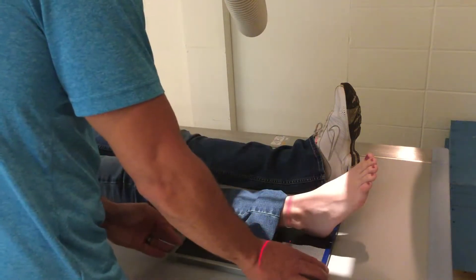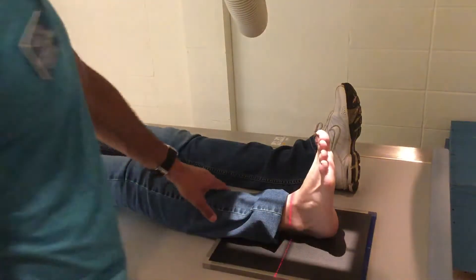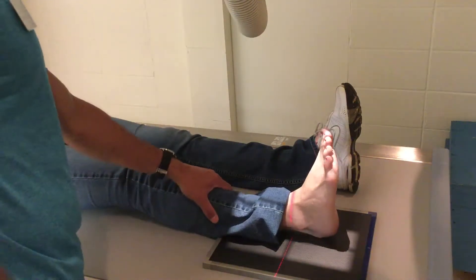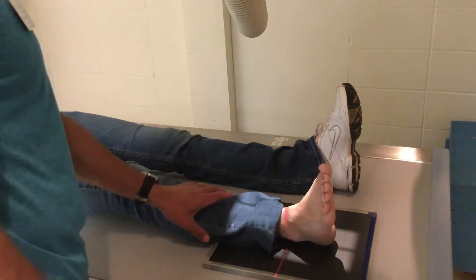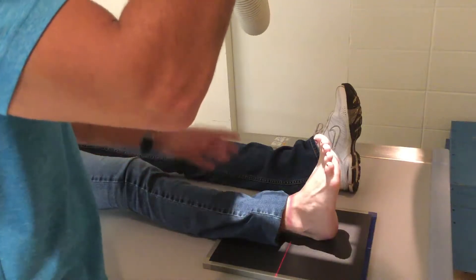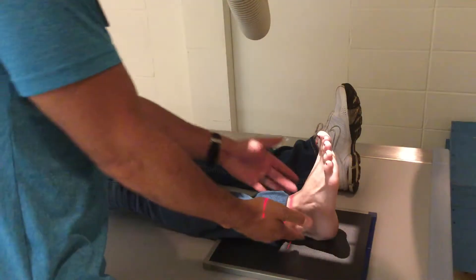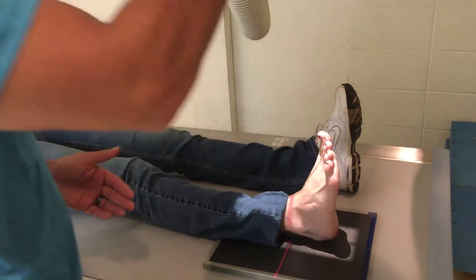When doing that, have your foot straight up. A real important thing to do is to have the patient dorsiflex their toes — pull your toes up towards your head. It can be a little uncomfortable, especially if they're hurt. You want to make sure the leg is straight up and down, because some people's feet lay to the side. You want them straight up and down. Center on the mid-ankle joint, which is basically right between the malleoli. Cone in left to right a little bit, top to bottom slightly.